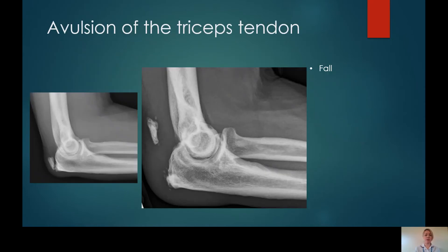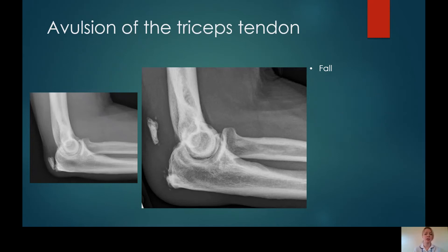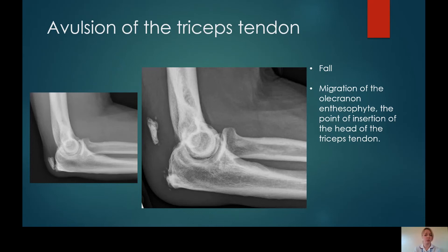This is an example of an avulsion of the triceps tendon. The image on the left is a previous radiograph, and this is what happened after the patient had a fall — there has been a fracture through that olecranon enthesophyte, which is displaced proximally. There is a large amount of soft tissue swelling present, which is another indicator of this injury. Another example of a tendinous avulsion you might see on an elbow X-ray is the insertion of the biceps tendon at the radial tuberosity, although these are less frequently seen on elbow X-rays.